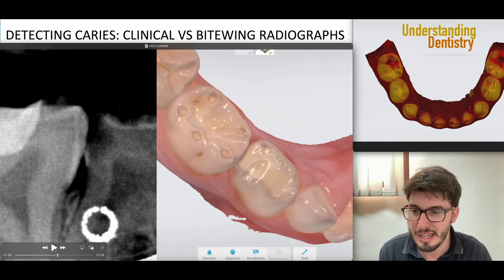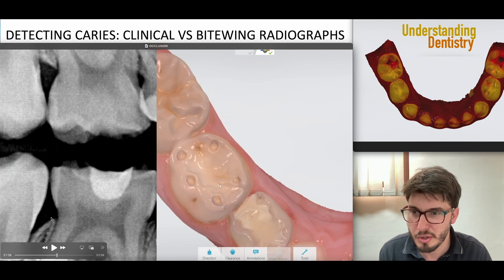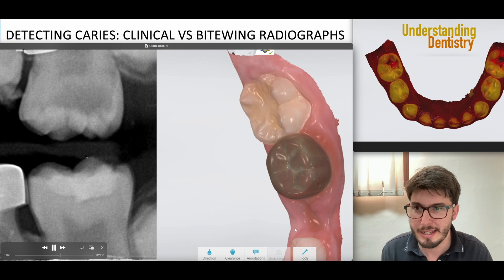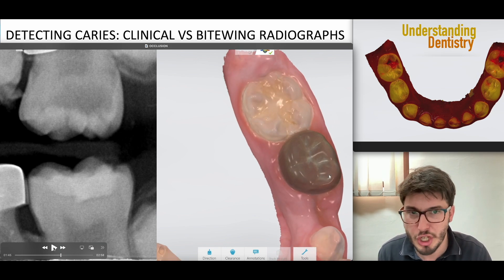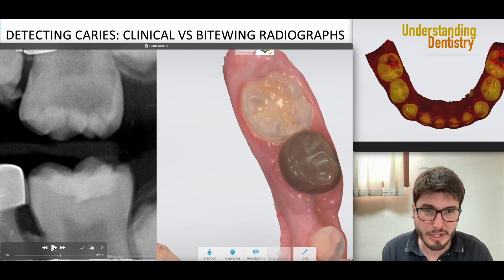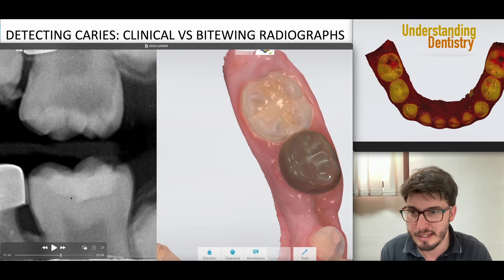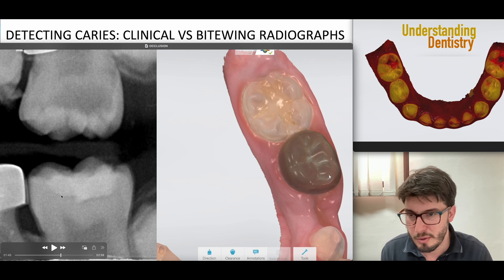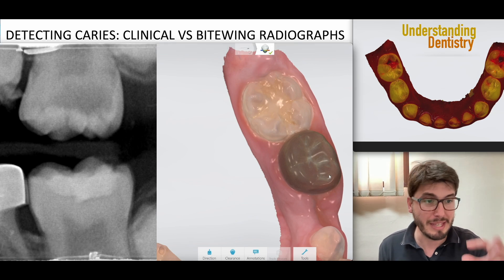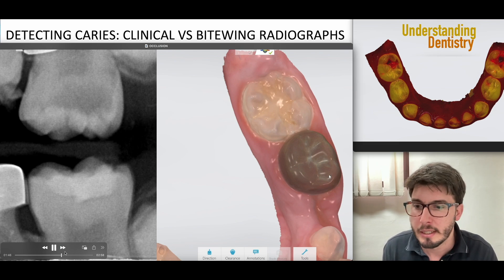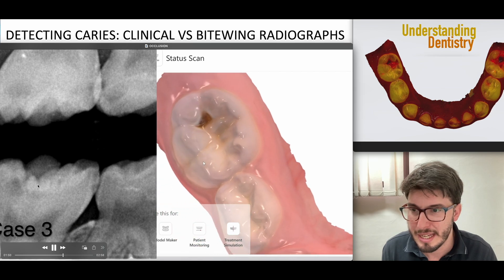Here is an old restoration with tooth wear showing even initial interproximal caries, and the dentine has a radiopacity that is not completely normal. There are changes in the radiopacity throughout. On the other side, we have a metallic crown and a resin restoration with a radiolucent line below it. If that line is regular, it could just be a lining material or the thickness of the base material — when too much base is placed, you see this line and it can be normal.